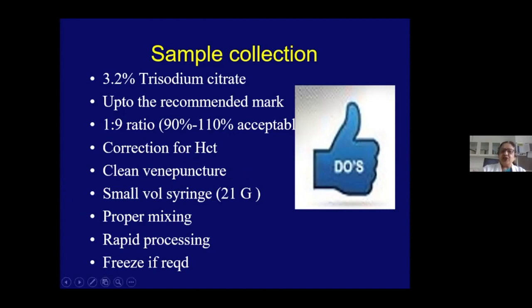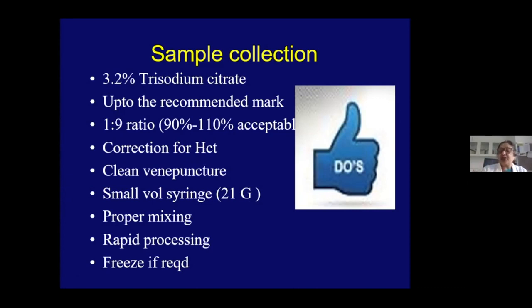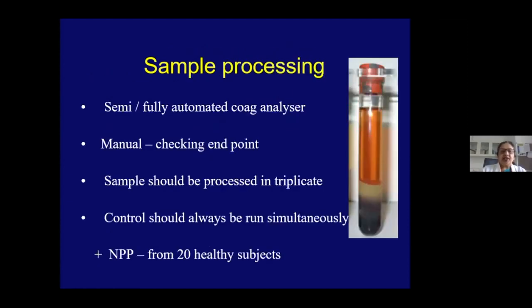There should be a clean venipuncture; multiple venipunctures introduce tissue fluid and lead to erroneous results. Once collected, the sample should be properly mixed by inversion — not shaking — to avoid froth formation, which activates blood and leads to fallacious in vitro results. If transport is needed, the sample should be frozen rapidly so that coagulation factors do not get spoiled.